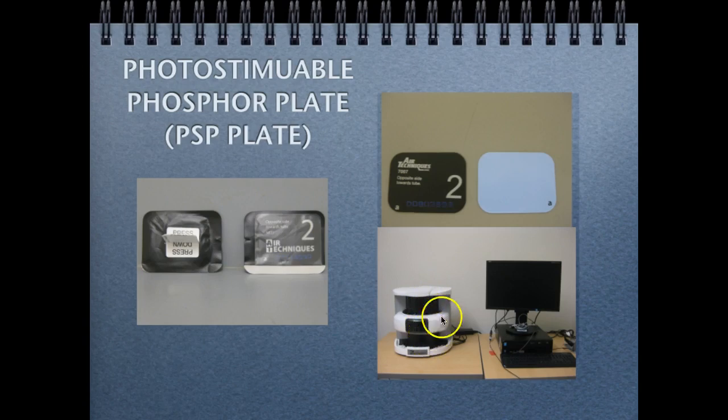And then when it's scanned, it talks to a computer with a program set up for phosphor plates, and then you have a digital image for your radiographs, for your images. So this is the phosphor plates.